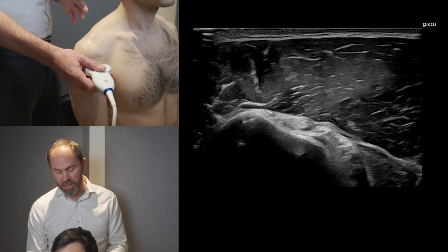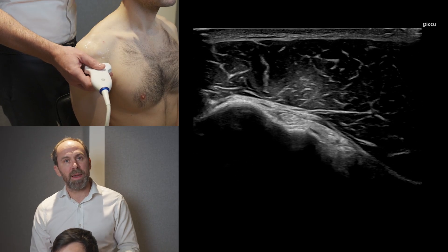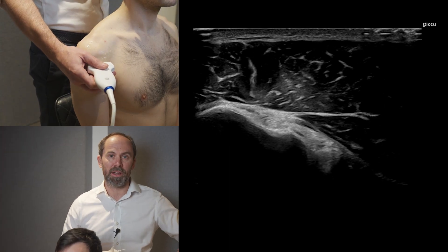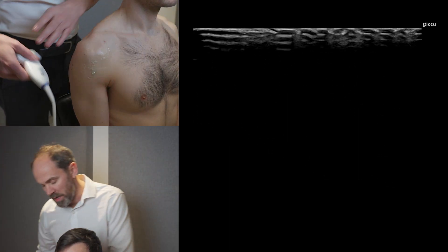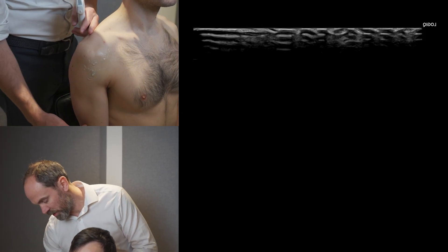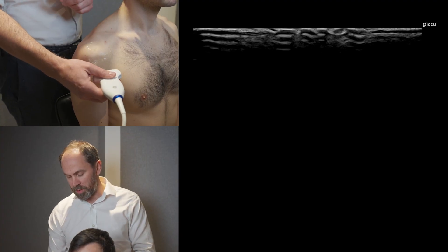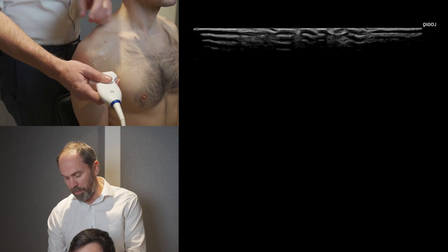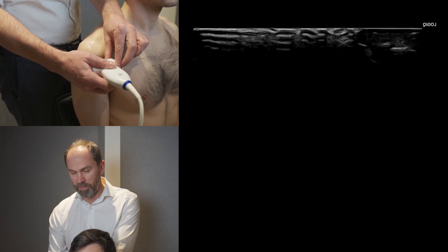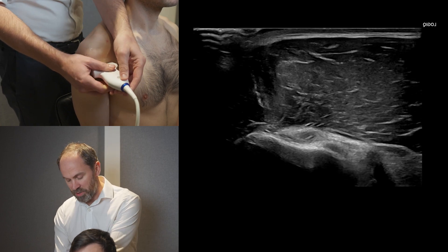The first thing you're going to do is make sure the patient is in the correct position. It's best to scan people without an arm on the chair, because that will bring people into abduction and that can be a problem. The humerus should be vertical — we're in a neutral position. Before placing the probe onto the patient, just check that the left side of the screen corresponds to the left side of the probe.